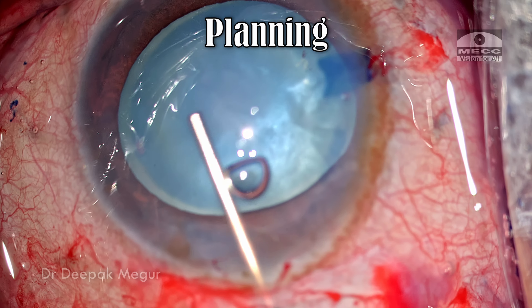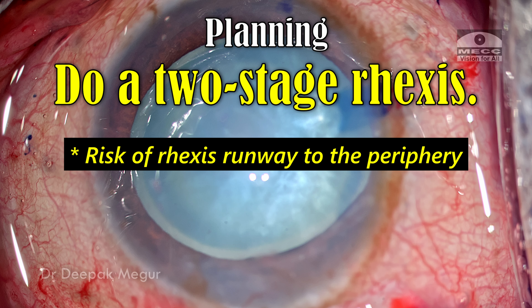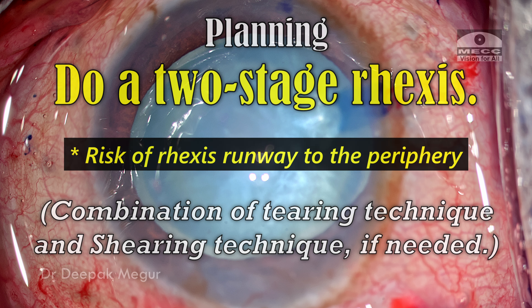The plan is to do a two-stage rhexis. There is a higher chance of the rhexis running away to the periphery during the primary smaller rhexis itself, so I'm going to use a combination of tearing technique predominantly and shearing technique when the need arises.